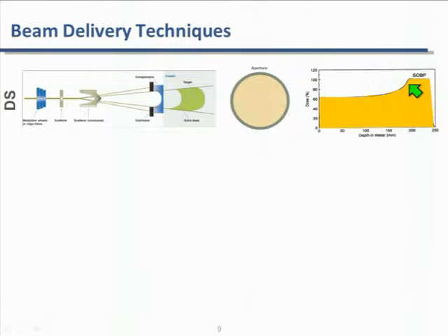You have a PDD with an SOBP, or spread out Bragg peak, and this is just a typical spread out delivery that you can see here. Now this entire delivery, this area in yellow, is covered almost instantaneously. You have the modulator spinning at very high speed that allows the Bragg peak at the distal end to be delivered, and then very quickly all the other subsequent ones with different weights to give you this.